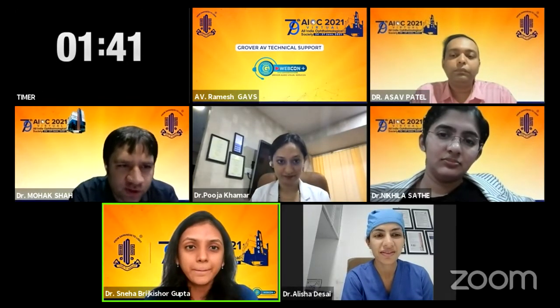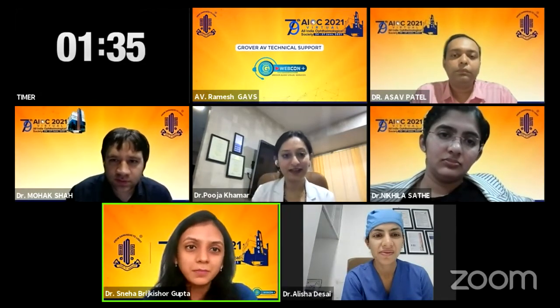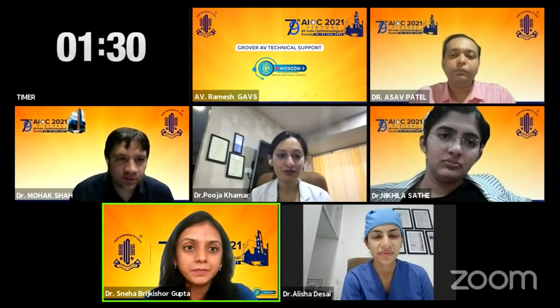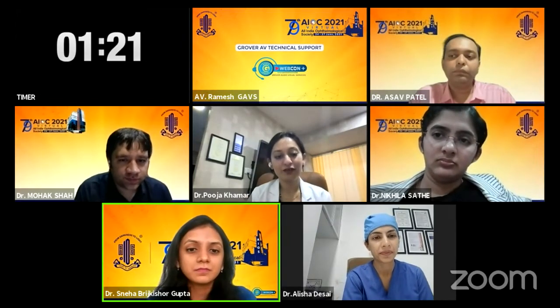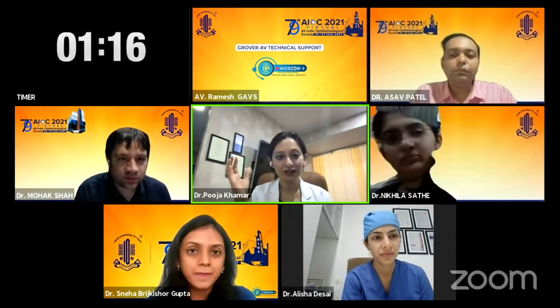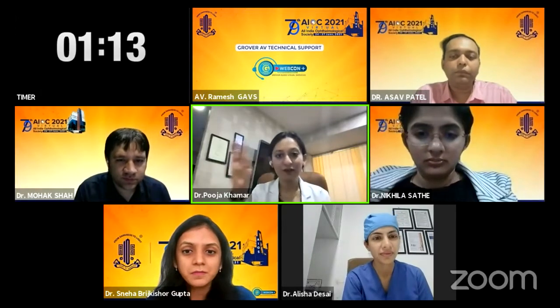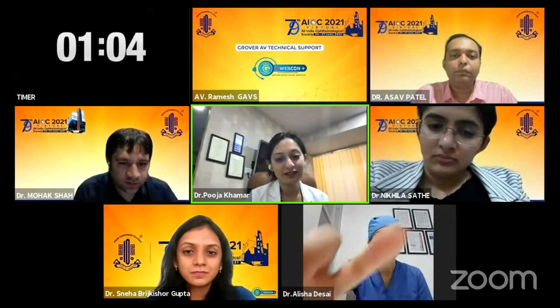I think you have done this on some keratoconus patients as well, Dr. Puja, right? And Dr. Ritika will present that as well for keratoconic eyes, and we recently published it. We have 2-year data which shows it's stable. That is why I was interested, because if the MEL 90 can also do it, then it would broaden the horizons of this treatment. And this procedure, what she showed, customized PTK, is nothing extraordinary. There you don't need to think about refractive surprise and all that. You're just regularizing the cornea. So if other machines can do it, that would be the best way forward.